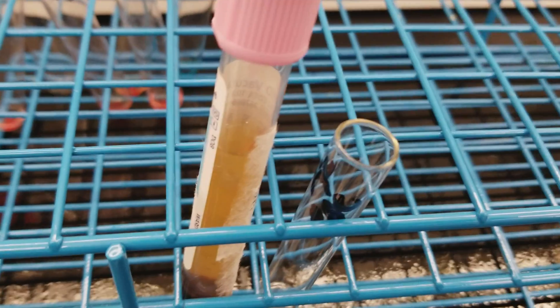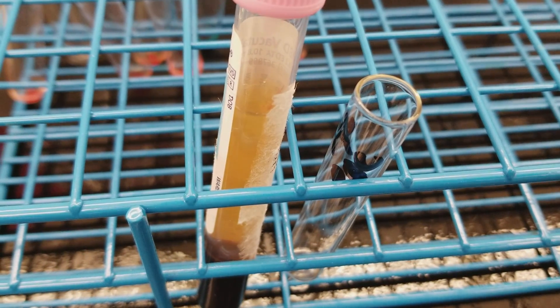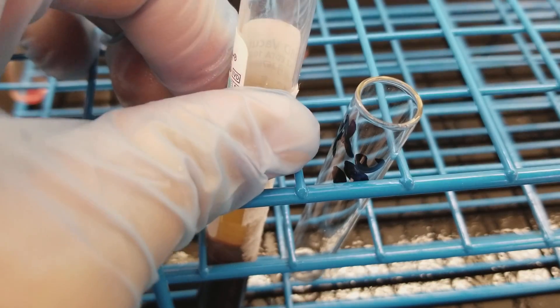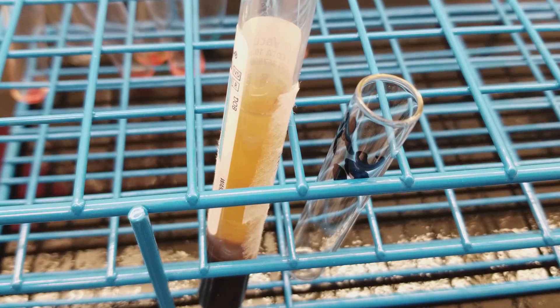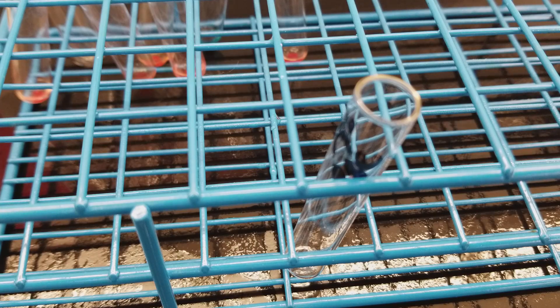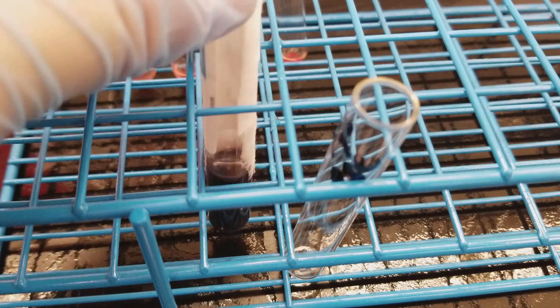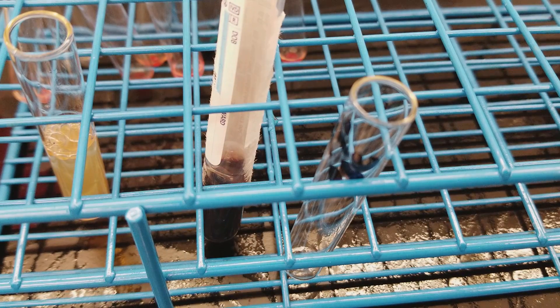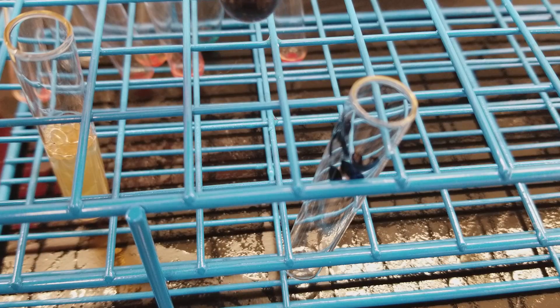Today I'm going to do an elution on this patient specimen. It's already been spun and I'm going to pull the plasma off first into a tube, and then I'm going to pull out the red blood cells — the packed red blood cells. I want to have a milliliter of packed red blood cells in order to get this started. So let's pull out a mill.